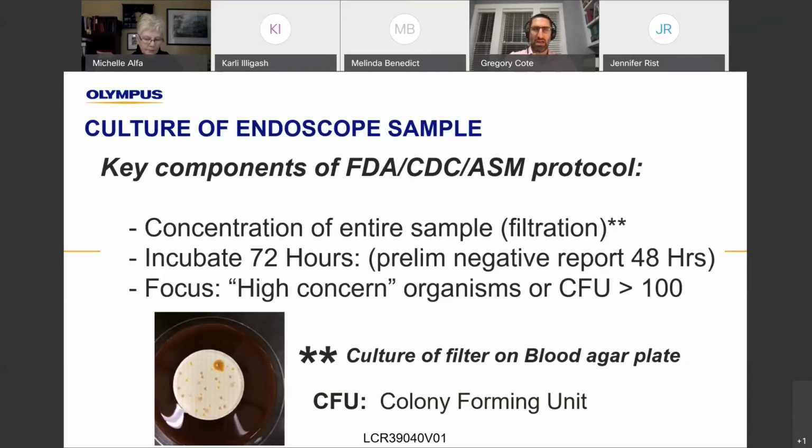So the other challenge is when do you do them? The ideal time, theoretically, you do this every Friday so that the samples can cook over the weekend when you're doing fewer procedures, and then you'll have your preliminary results on Monday, and you can bring the endoscopes back into circulation. But it's a bit of a flawed approach, because let's say you have your best, most experienced technicians reprocessing scopes on Fridays. Well, you may have falsely low rates of contamination. You may have a skewed sample.